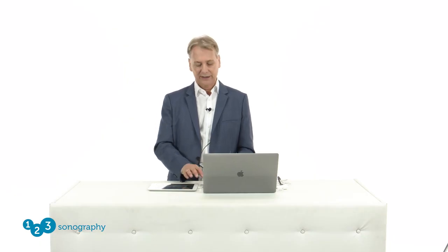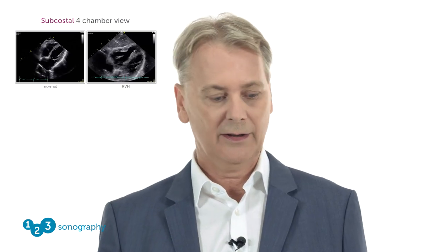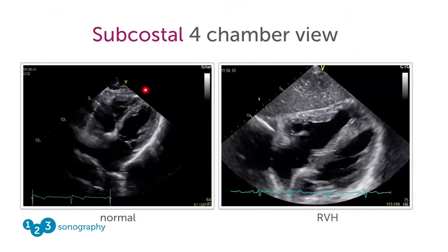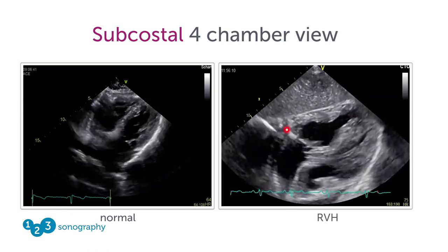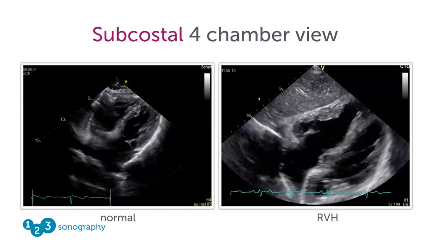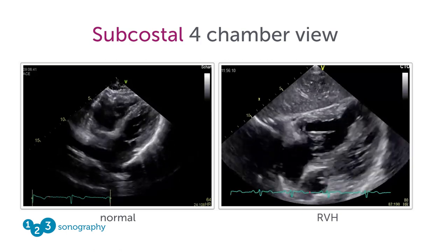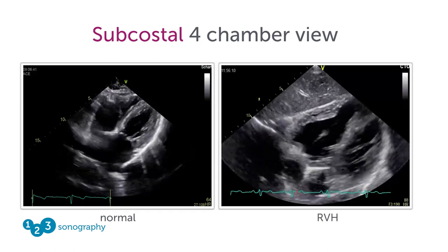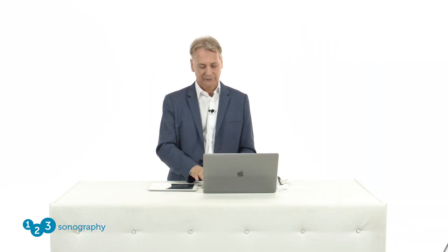Let's turn to the subcostal view — this is the preferred view to look at the thickness of the right ventricle wall. Let us compare a normal individual with normal right ventricle thickness and a patient with significant right ventricle hypertrophy. Be aware that measurements are sometimes very difficult because the right ventricle is strongly trabeculated. So don't measure into the trabeculae, but really look at the compacted part of the right ventricle.